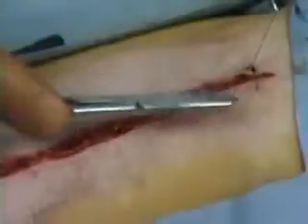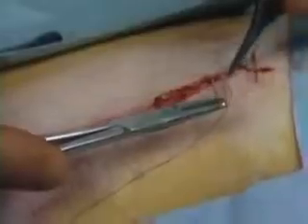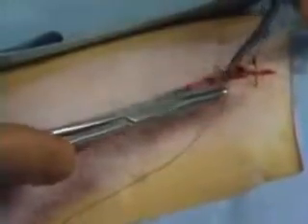Understanding the suture pattern's tendency to oppose, evert, invert, or tension relieve helps the student rationally choose a pattern best suited for a given surgical problem. This tape will cover techniques only. The student is encouraged to review in current surgery textbooks the specific suture patterns and their indications.